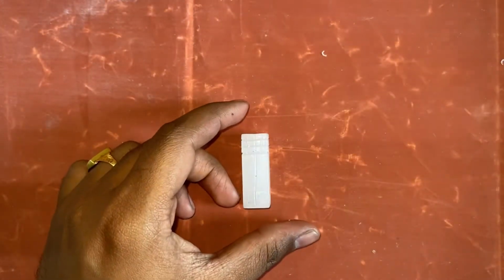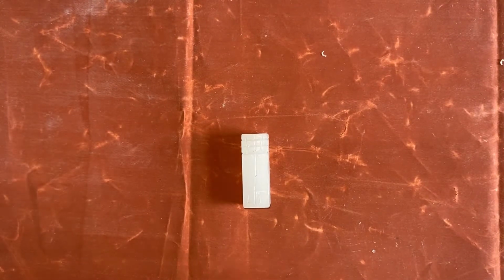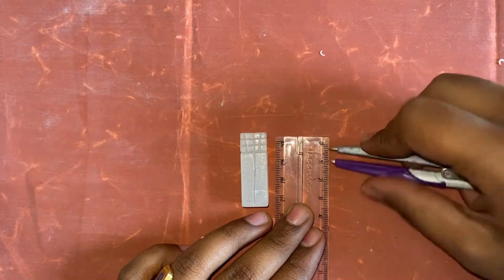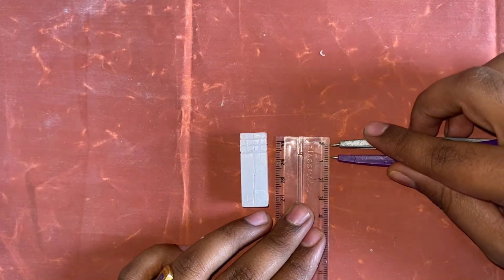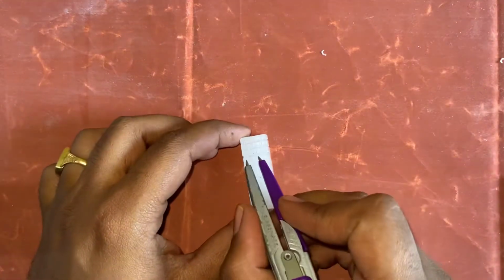Now by using the scale and the divider we have to measure the mesiodistal dimension of the crown, which is 5 mm. Now mark it on the wax block.